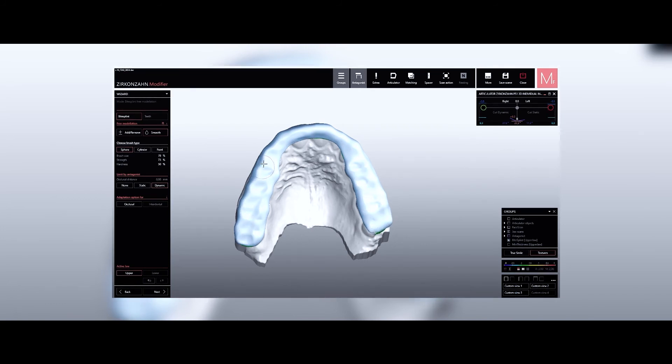Following the wizard step by step, we get to the final design phase, ready to start the milling process.